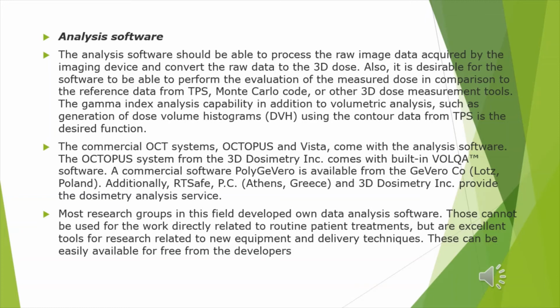The gamma index analysis capability, in addition to volumetric analysis such as generation of dose volume histograms, DVH, using the contour data from TPS, is the desired function.